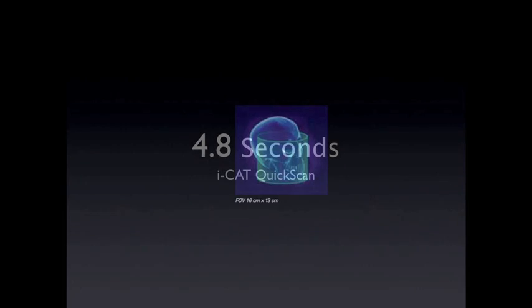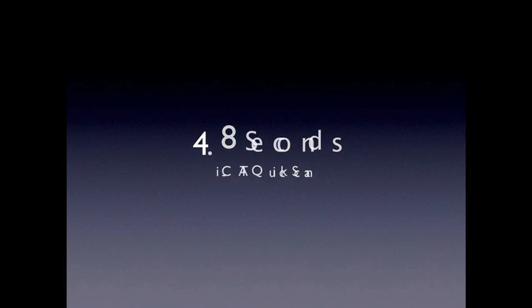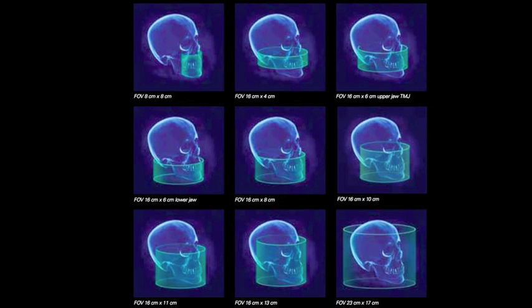the advent of a new scanning technology from the iCAT Next Generation machine is now scanning this area of interest in approximately 4.8 seconds. It's called the iCAT Quick Scan, and this was not available at the time of the original podcast publications. With this 4.8 second scan, we're able to decrease our patient exposure to 45 microsieverts, cutting it almost in half of what we used to do with the full volume scan.